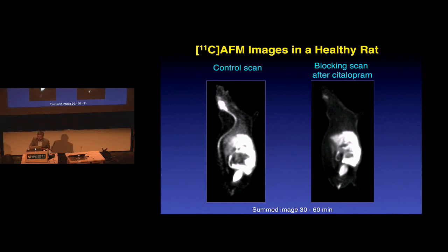So how are we seeing this with that rotten PET resolution of 2 or 3 millimeters? The trick is we've got great contrast. You're seeing a poor rendition of great contrast, which still comes out as very good contrast. So we might be at 10 to 1. We're probably 3 to 1 here, but we can still see it. Then we said, well, that's all well and good.